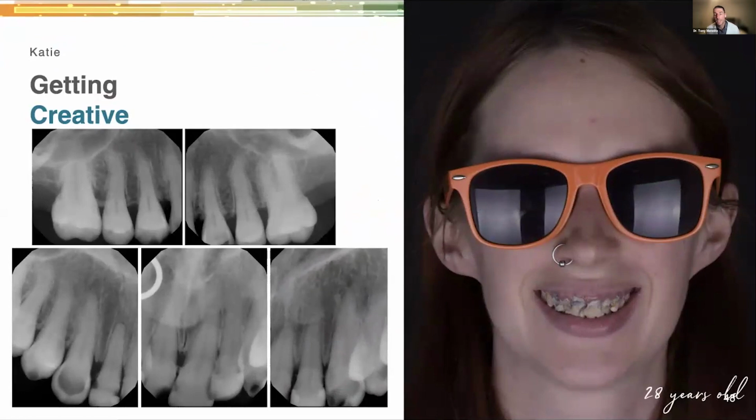So once again, I think the take home message from this, and Meredith and I approached it a little bit differently, is that printing is such a great problem solver in your practice because of how economical it is, and you can make it what you want. You just have to be a little bit careful about case selection and what you're promising to patients with these materials as they evolve. What's different about 3D printed materials versus ceramic materials and really all the other materials we've ever had in dentistry is that the innovation is happening quicker than our science and our data can keep up.